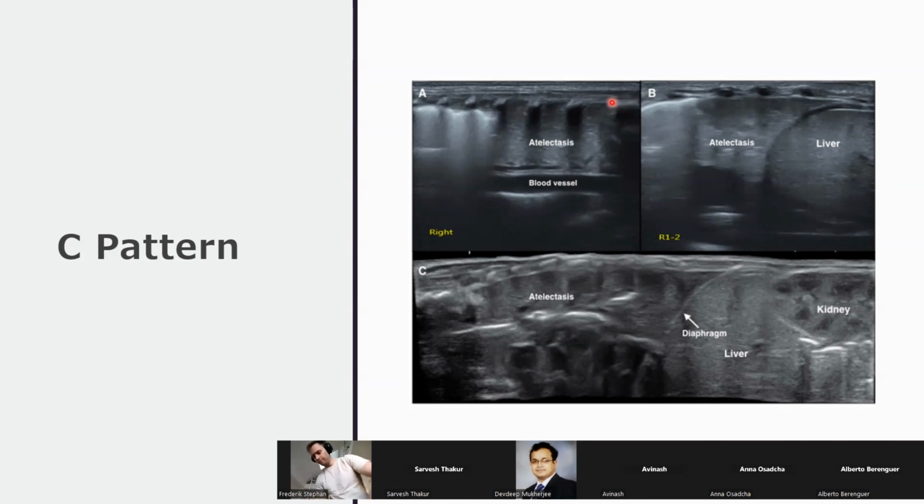What you have to be really careful about is what is happening to the rest of the lung, because there's other areas of the lung that may well be aerated, maybe with a B profile, which will undergo distension. And the risk is by focusing just on the atelectatic area, you might be causing problems in the other area of the lung, and you might cause that area of the lung to pop.